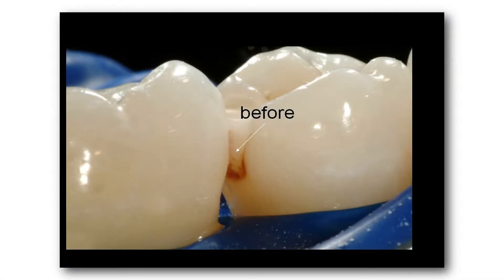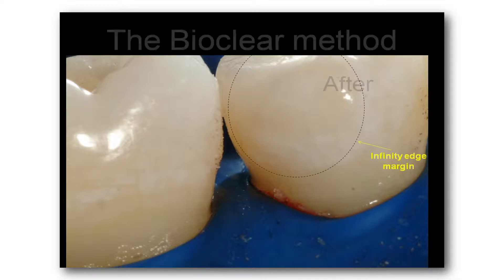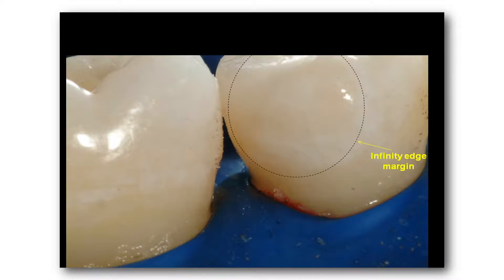So let's go ahead and click forward. You take a look at the BioClear method — we're modernizing that old G.V. Black cavity preparation with a modern infinity edge restoration. And so that's what this looks like. The little dotted line is showing you where the actual extension is for the infinity edge. Next slide, we're going to take a look at a G.V. Black cavity preparation next to a saucer preparation. This has multiple advantages for a composite resin restoration, and it allows us to get a true infinity edge.